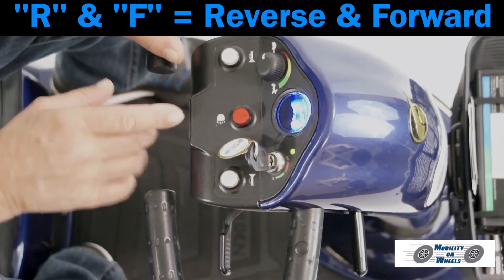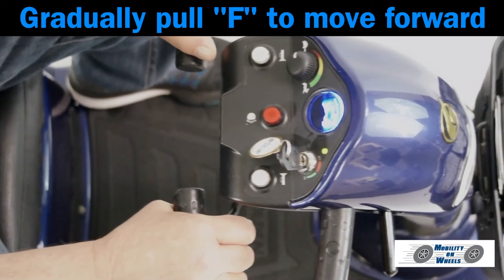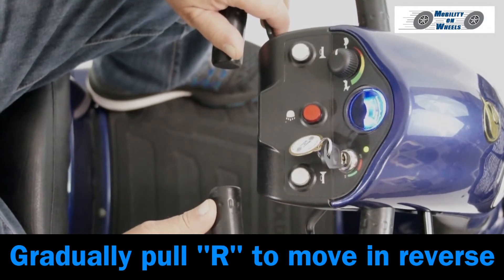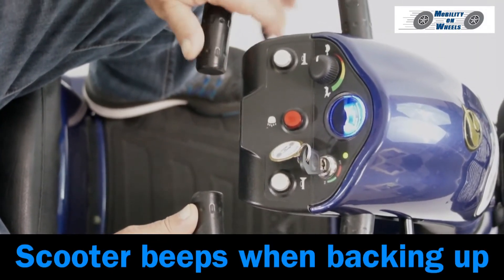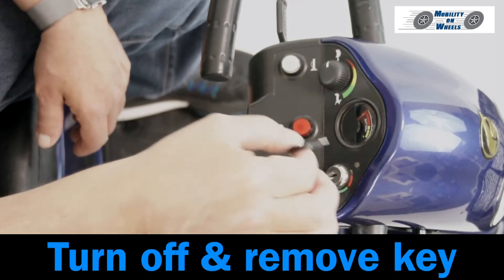R and F equal reverse and forward. Gradually pull F to move forward. The scooter automatically brakes when you let go of the throttle. Gradually pull the throttle on the left side and the scooter will go in reverse. The scooter beeps when backing up, and automatically brakes when you let go. Turn off and remove the key when done.